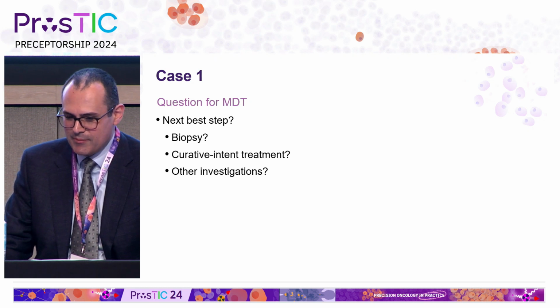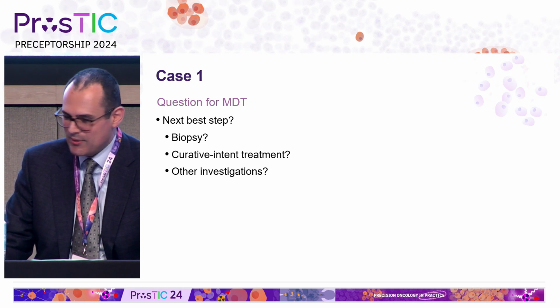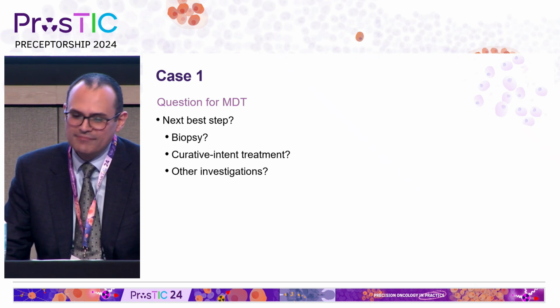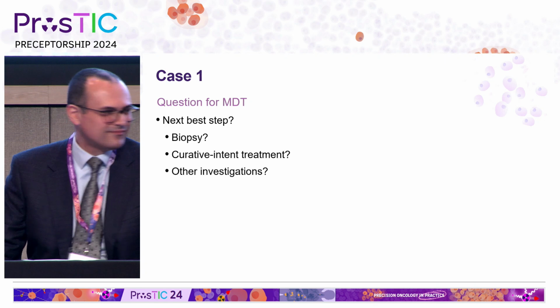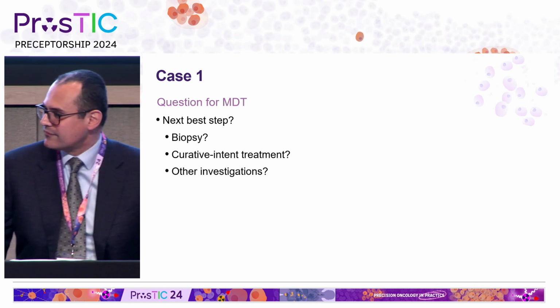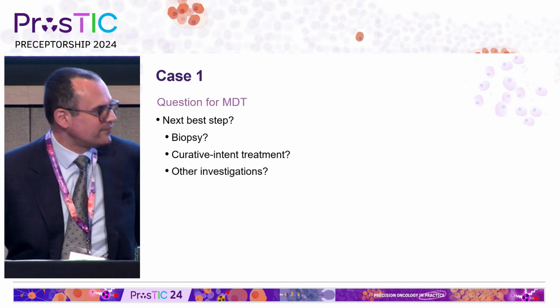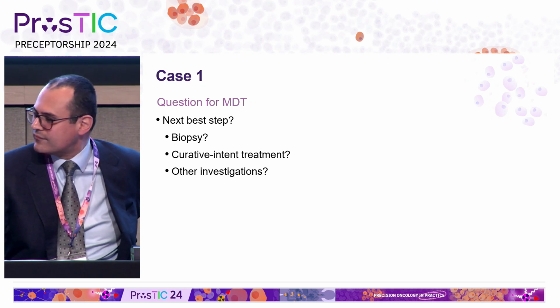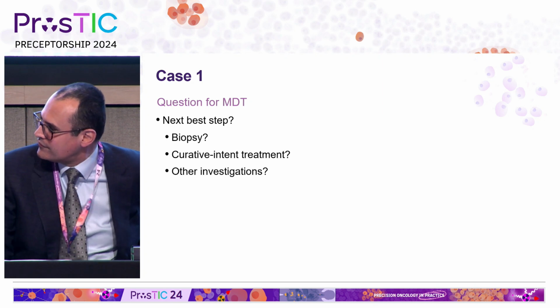Yeah, I think this patient will eventually get a biopsy. Just need to have a look at the whole study, but definitely... Sid, you'd get an FDG before a biopsy, come on. Yeah, come on, you'd get an FDG. Yeah, so we did an FDG. In fact, that was the conclusion of the Peter Mac MDT: let's do an FDG.